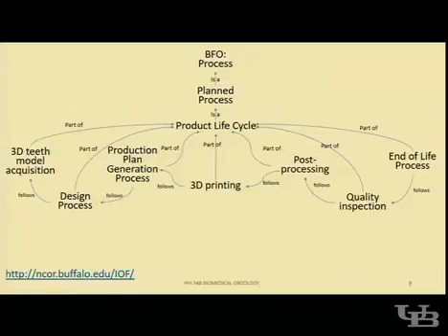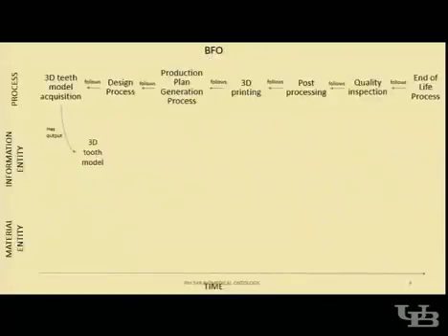So this process precedes another process. So after this process will follow, and so on. So I will cover each process one by one. So we start with the 3D teeth model acquisition, where from this model acquisition, we will have the output, which is the 3D tooth model of the patient.